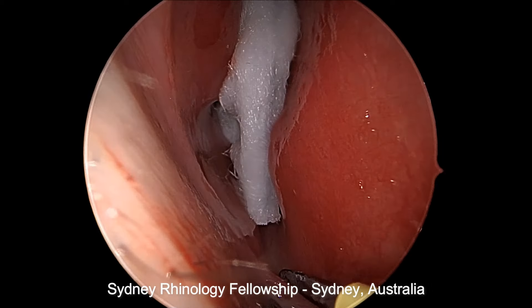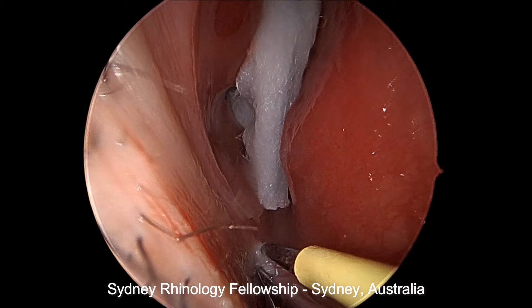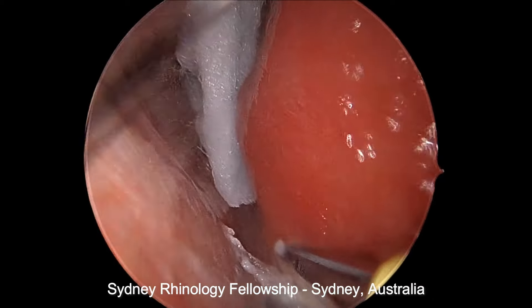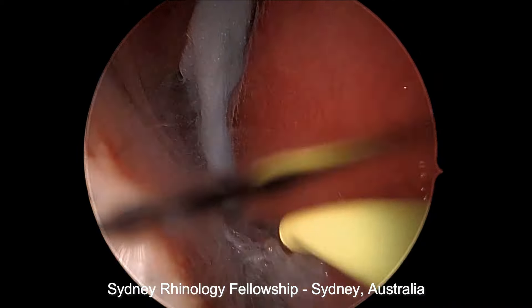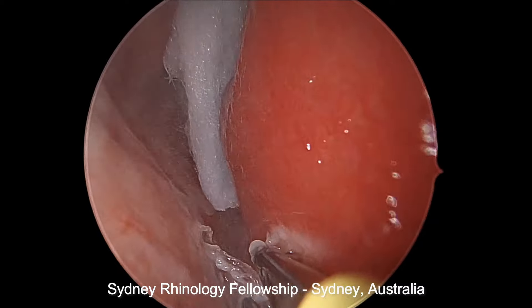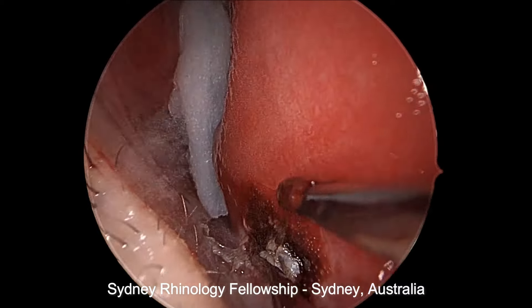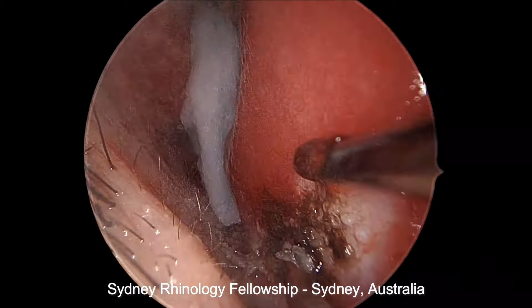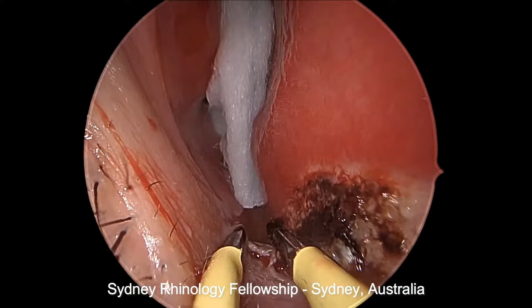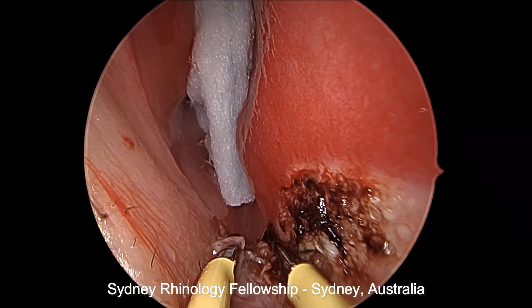Using a micro-bipolar forceps, the feeding vessel to this telangiectasia is first cauterized, then the telangiectatic vessel itself is followed with a very superficial cautery. The goal here is not to over-cauterize the surrounding tissue, but to ensure that you get adequate ablation of the vessel.